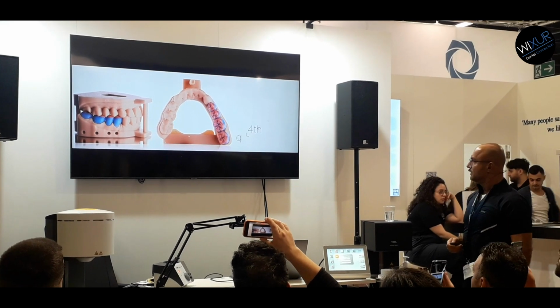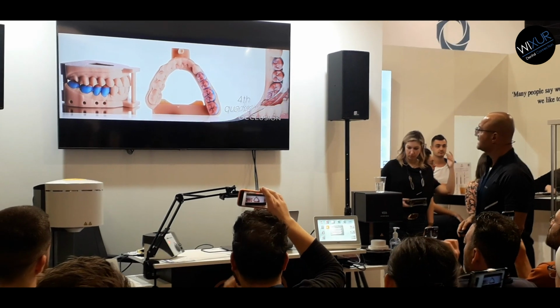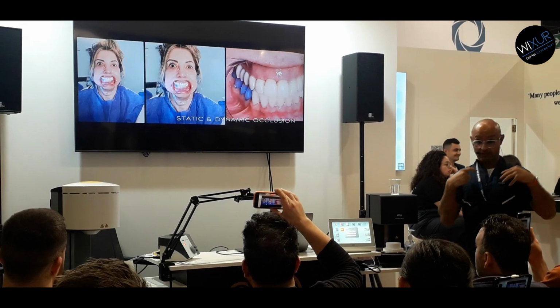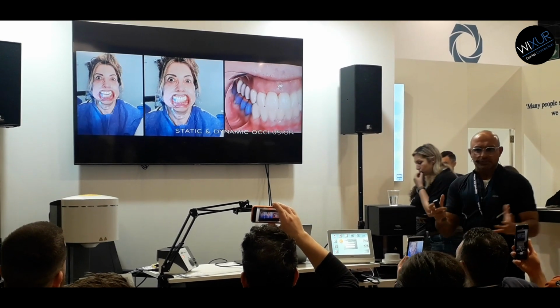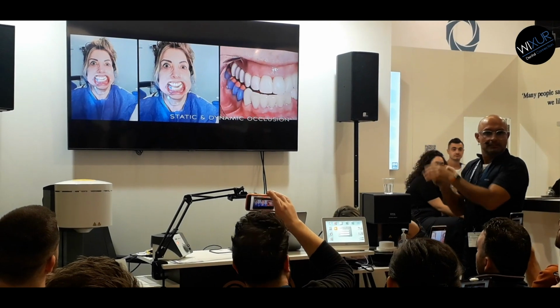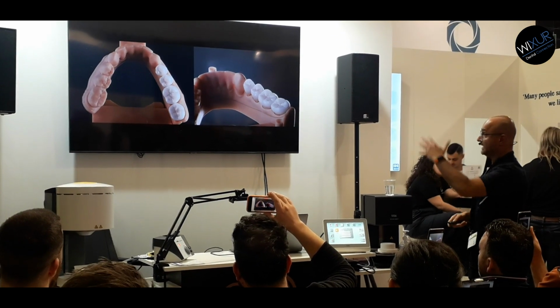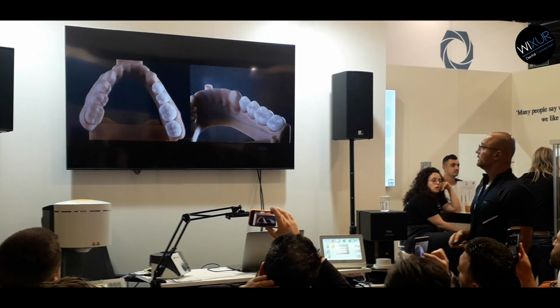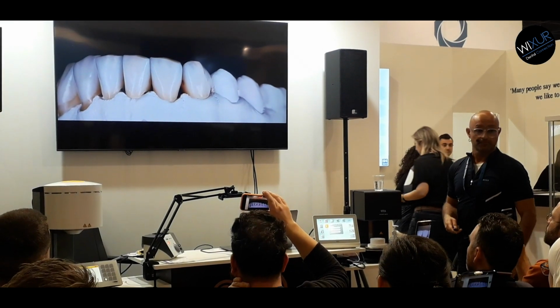So we create new occlusion. It doesn't need to be beautiful. It goes to the mouth. And the same, patients start chewing on it. So when you see that everything is intact, everything doesn't come off or break, and everything is comfortable, then you know your work is good. And if you find some mistakes here, you fix it. You don't go directly to ceramics. Good. Again, come back to me, clean it, press it, glaze it, mechanically polish, and 4 weeks later, the patient comes back to me. I finished the anteriors.